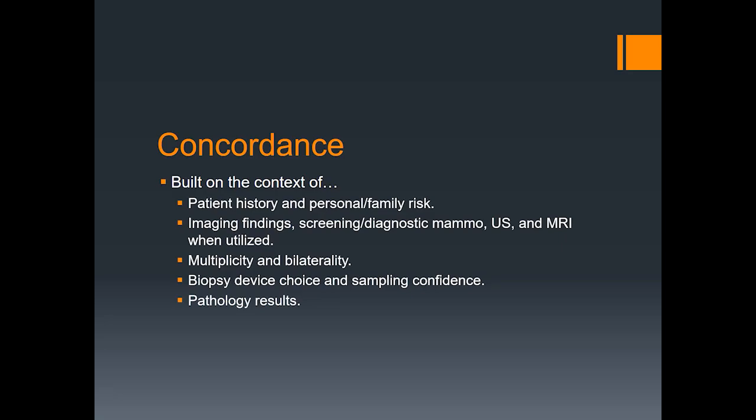And of course, our pathology results, either as we read the pathology report or sometimes when we call the pathologists and talk about what they're seeing in terms of the size of the lesion, and sometimes in our RAD-Path correlation conference as we describe such things that are a bit more common in the world of tomosynthesis, certainly radial scar and complex sclerosing lesion.